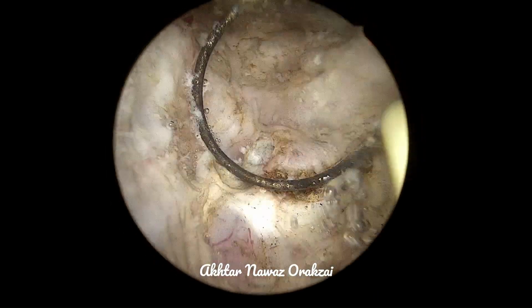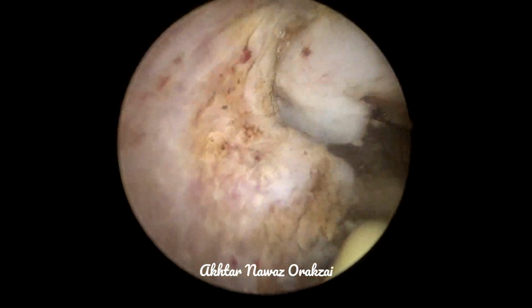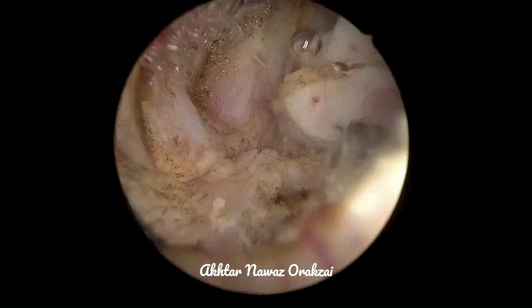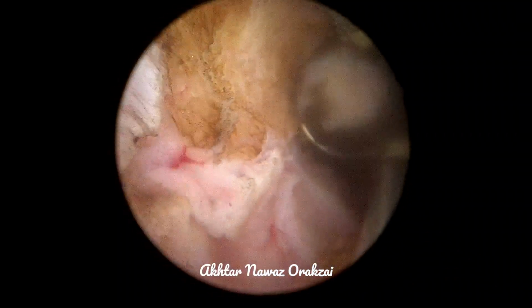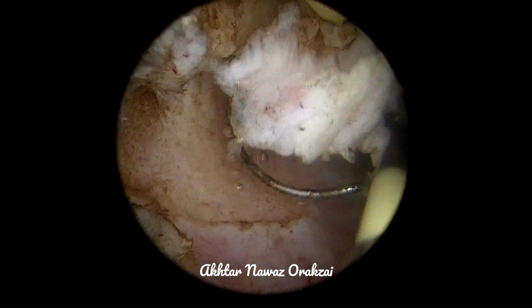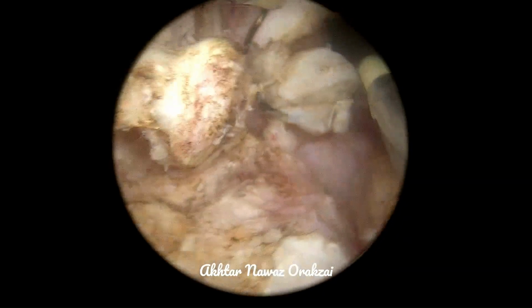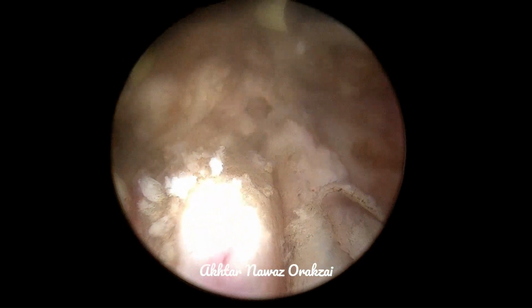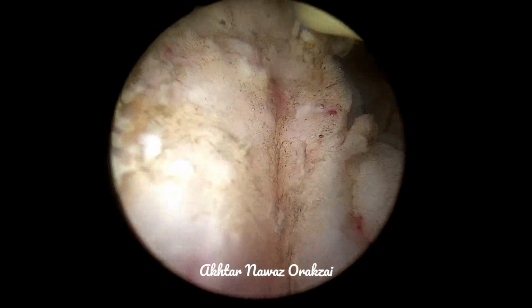Number one is that you may encounter a lot of bleeding during the procedure, and the more you try to coagulate that bleed, the more it bleeds. That bleeding usually cannot be controlled easily. For that, you may have to inflate the balloon in the prostatic cavity under fluoroscopic guidance.